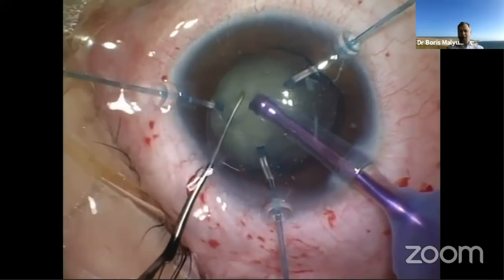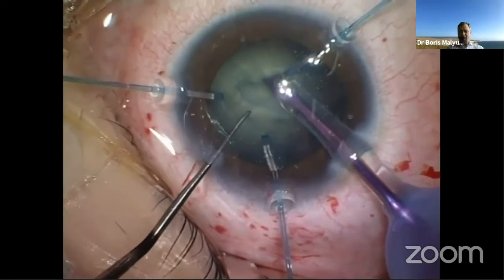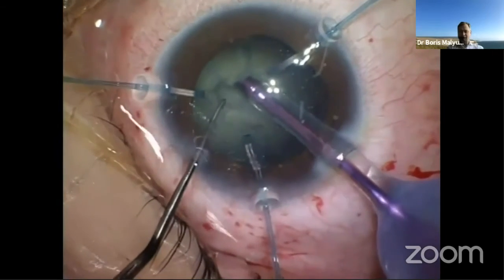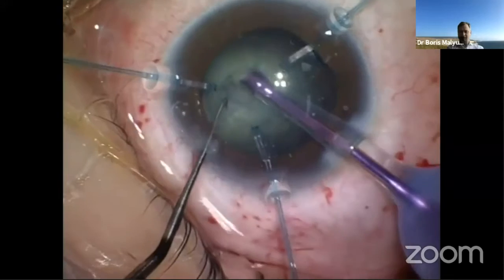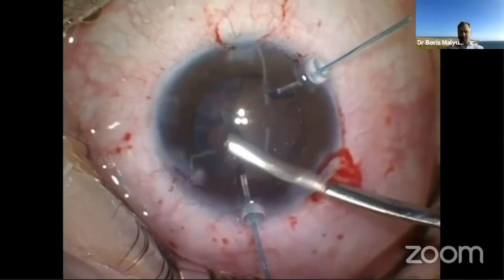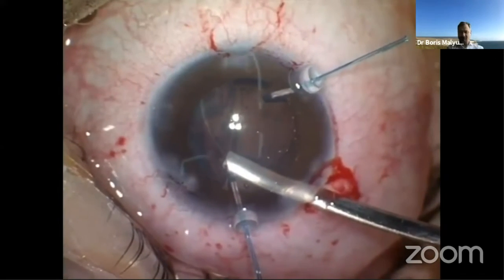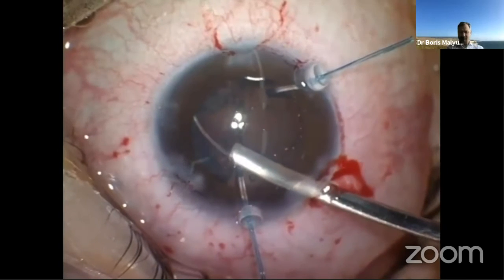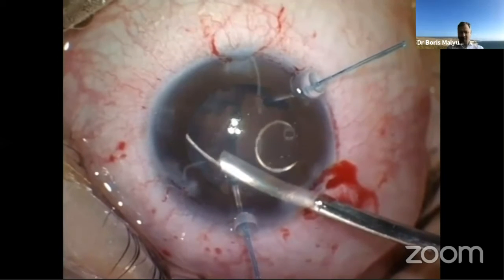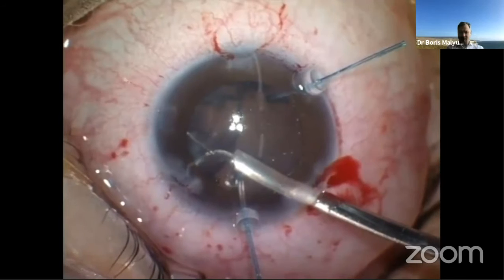As shown here, there was a significant lens subluxation. Now, phacoemulsification is being performed with the help of the capsular hooks that are supporting the capsular bag, and you can see here that the lens is quite stable. Now I'm injecting the modified CTR inside the capsular bag while there is some cortical material still present, the reason being to avoid aspiration of the equator of the capsular bag, which is not uncommon in that kind of surgery.